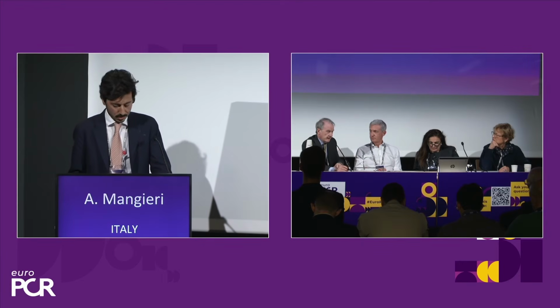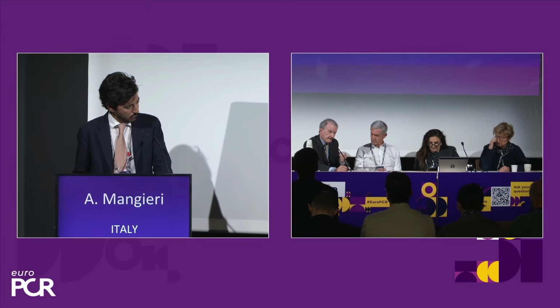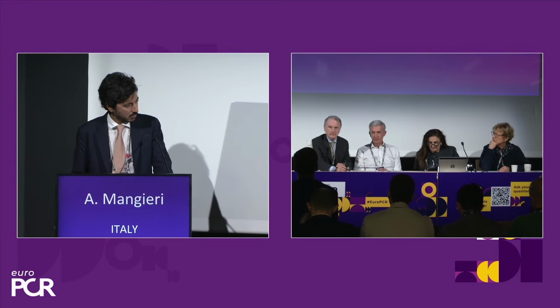And one data that we didn't publish, but I really pay a lot of attention to, is how the PDPA behaves. At the end of pre-dilatation, PDPA can be 87, 89. If after 1 minute it is 92, 93, 95, that's good. If after 1 minute it is 84, 83, that's bad. So this is not the absolute number, but what happens after 1 minute, 2 minutes. I don't wait 5 minutes, just 2, 3 minutes.